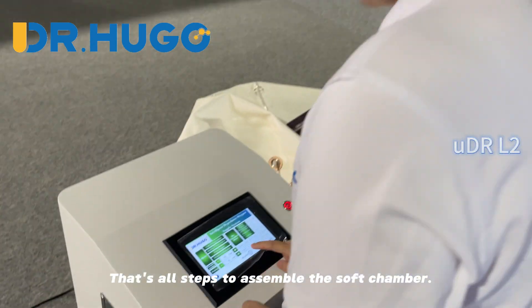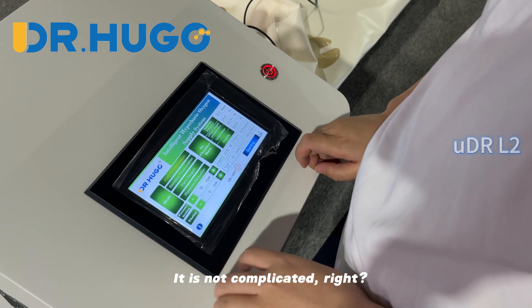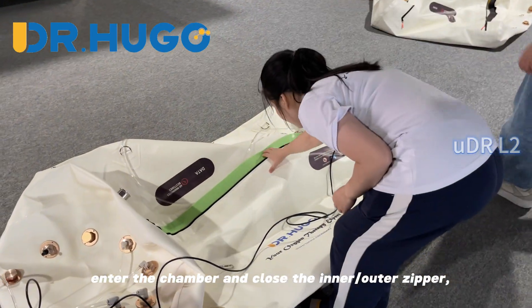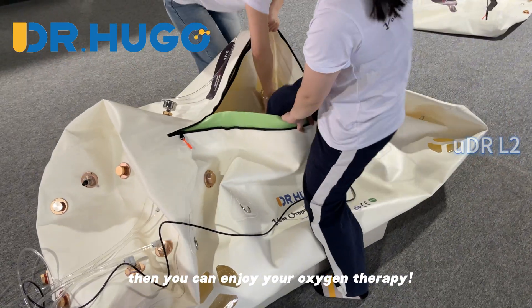That's all the steps to assemble the soft chamber — it's not complicated, right? Turn on the machine and set up the pressure. Enter the chamber and close the inner and outer zipper. Then you can enjoy your oxygen therapy.